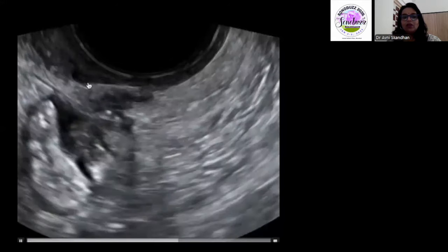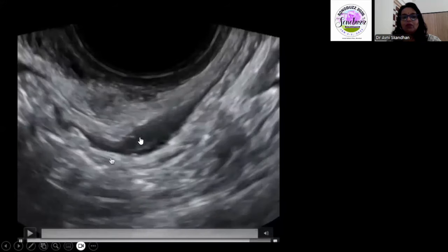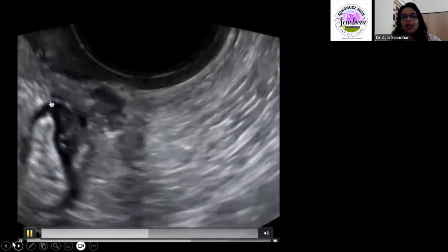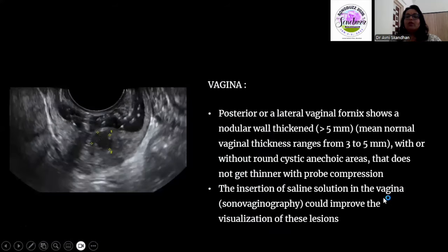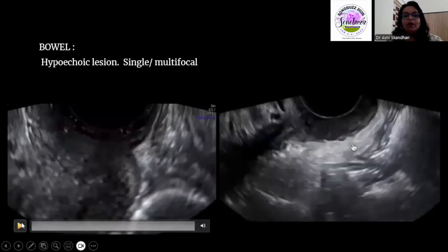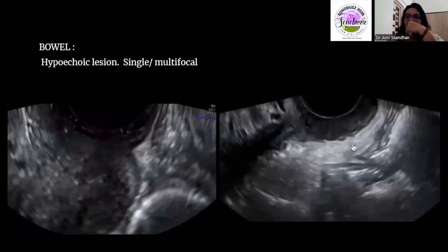Here you can see a deposit extending from the bowel wall, extending along the rectovaginal septum and into the vagina. For the vagina, you appreciate it better with jelly or saline in the vaginal cavity, seen as focal thickening or a hypoechoic deposit within the vaginal wall. Bowel can also be beautifully appreciated on a transvaginal scan. Placing the transvaginal probe in the posterior fornix gives better visualization of structures posterior to the cervix.